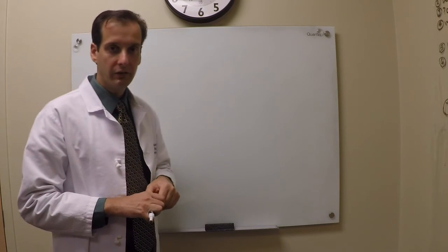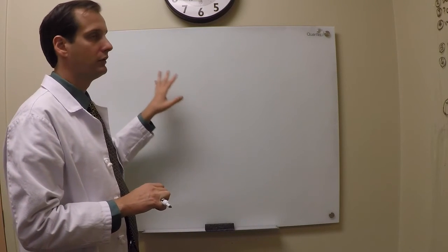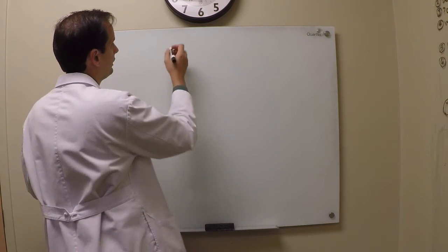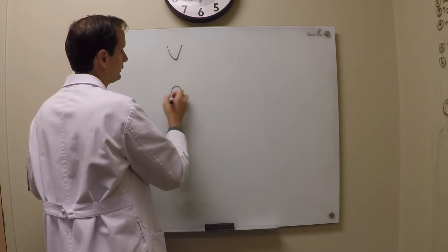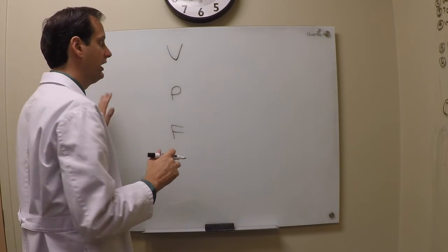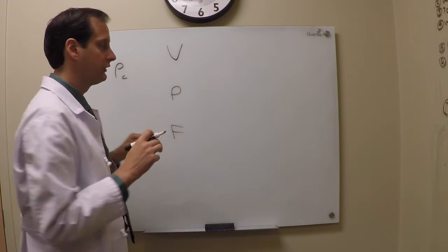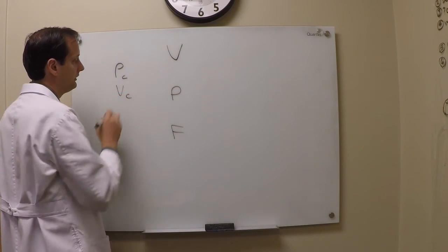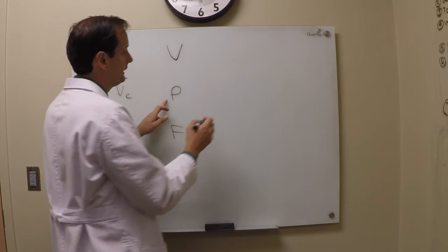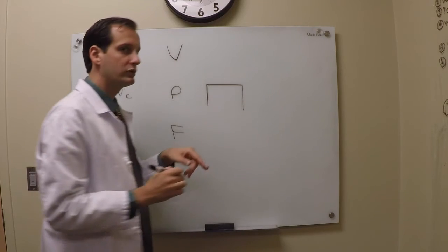In talking about volume and pressure and which one is constant, which one is variable, you can learn a lot by looking at your respiratory tracings. And there are 3 in specific that you'll want to look at. You want to look at your volume tracing, your pressure tracing, and your flow tracing. So the first example that we'll talk about, let's say we want to have pressure held constant. We're in a pressure control mode of ventilation. And volume is going to be variable. So time cycled, pressure limited. What you're going to find is that your pressure, in theory, should look somewhat square-like.